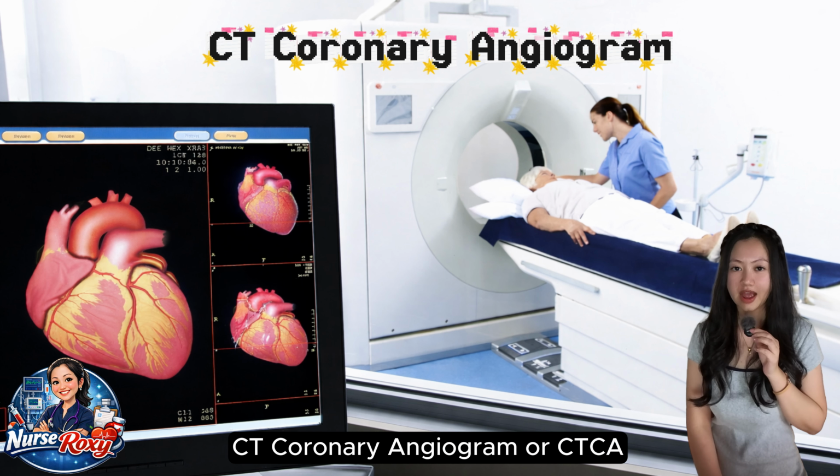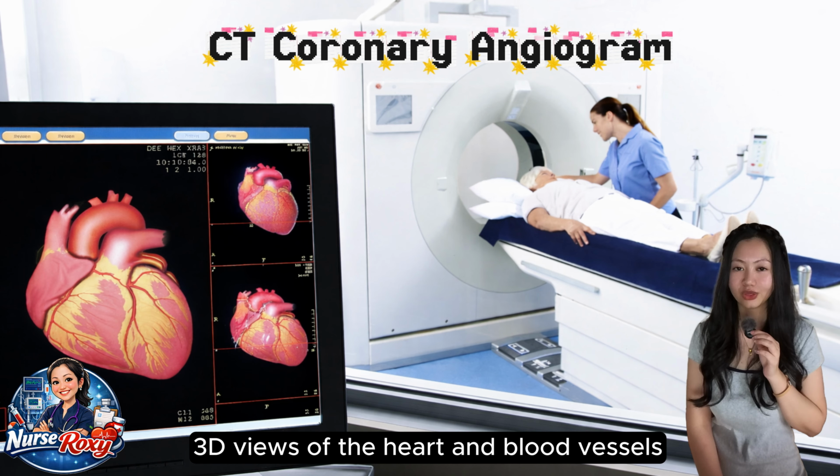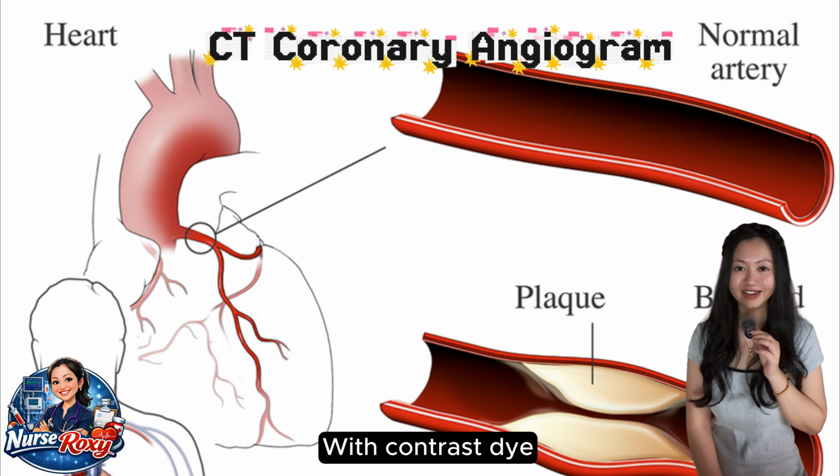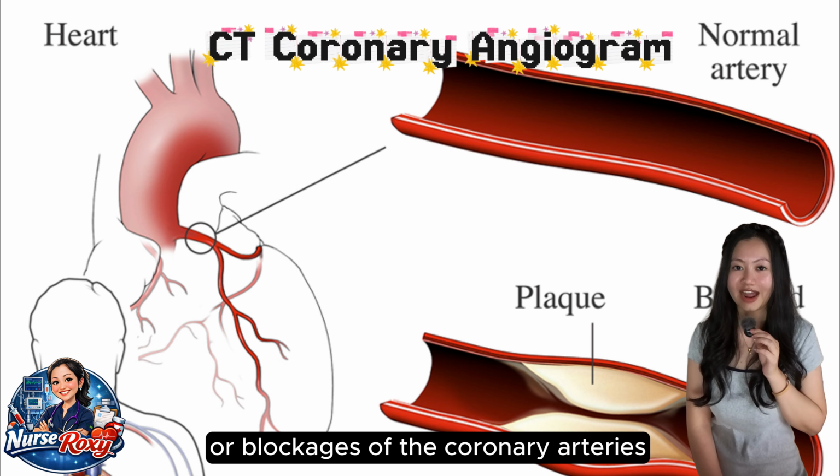CT Coronary Angiogram or CTCA uses multiple X-ray images to create detailed 3D views of the heart and blood vessels. With contrast dye, it can clearly detect narrowing or blockages of the coronary arteries.